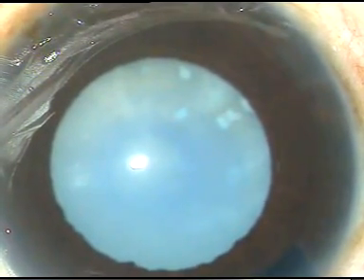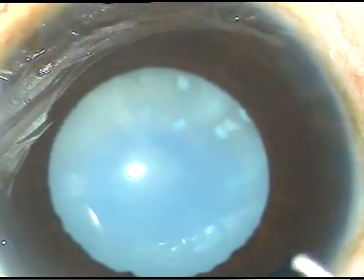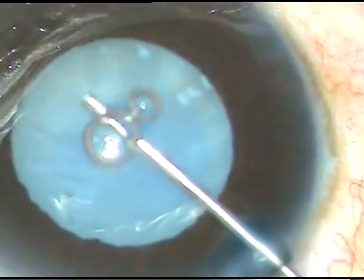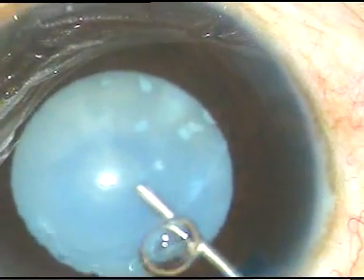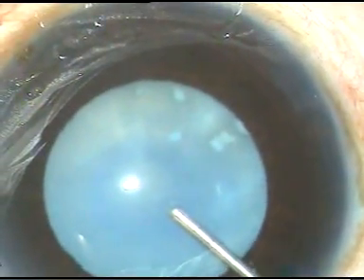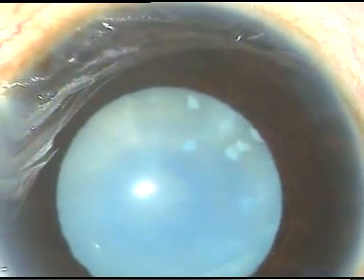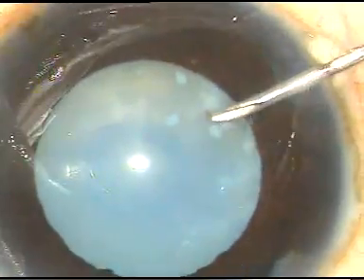Now, in this case, I am going to use Oro-Coat. It is a combination of chondroitin sulfate and sodium hyaluronate, each 2%. It is from Oro-Lab, India. It is called Oro-Coat.